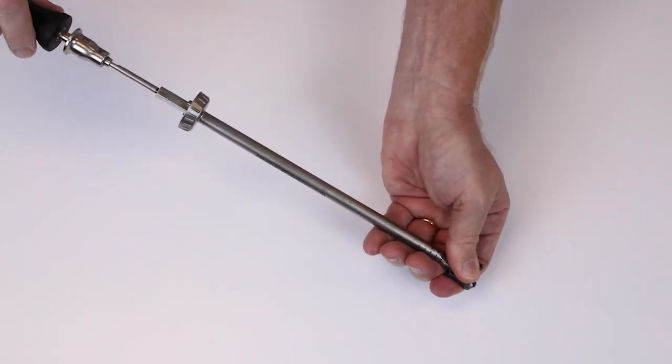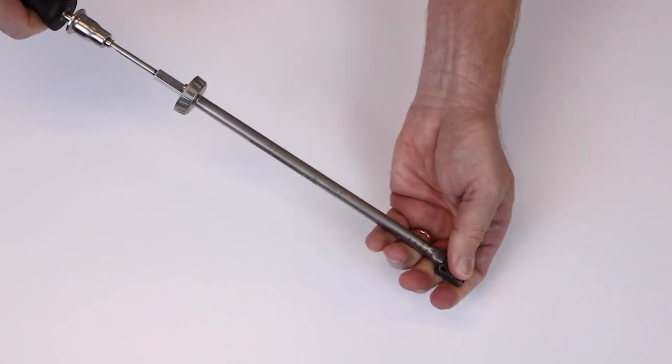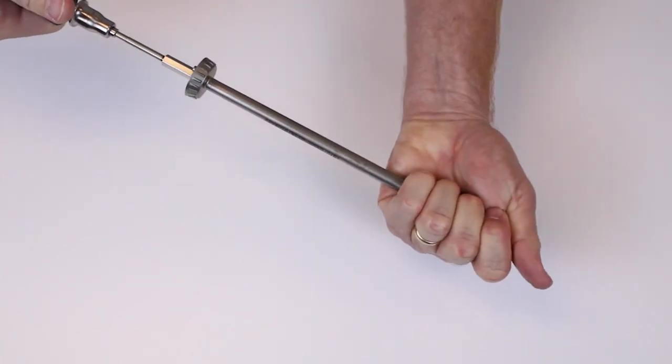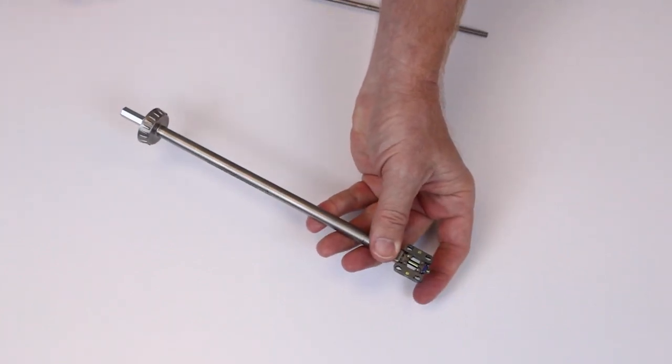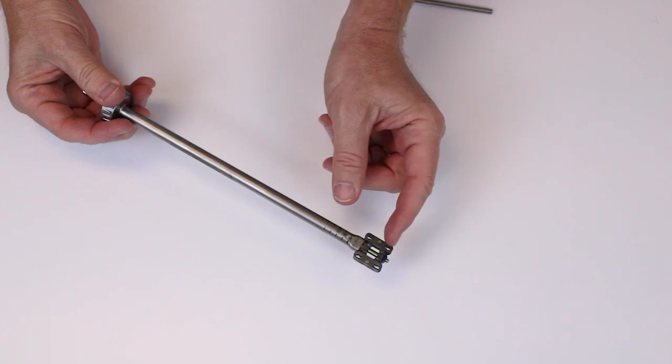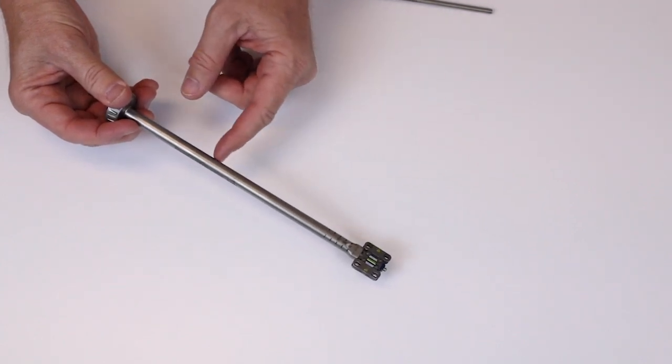The lockout screw torques out and then can be removed. Now you have an expanded implant with a lockout screw still attached to the tube.